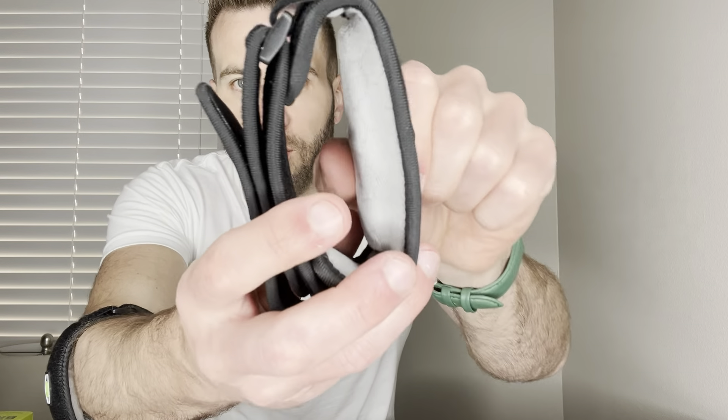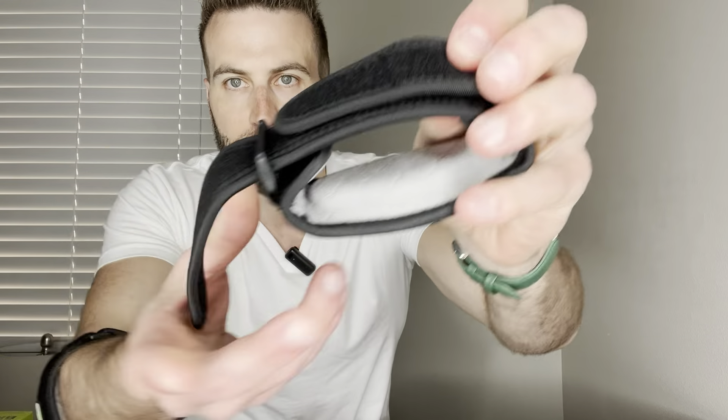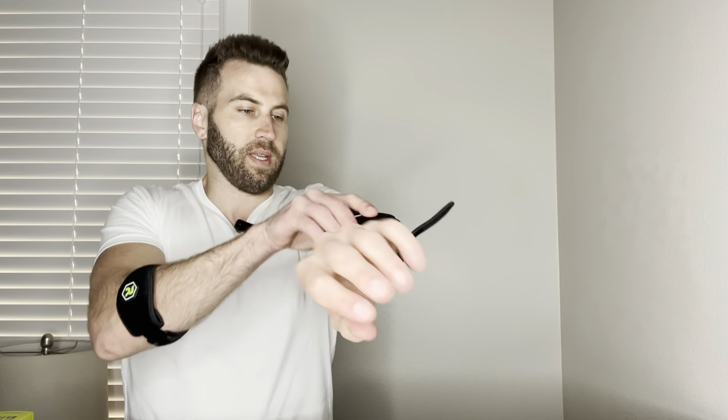Just to show you — give you the quick vibe — we've got this nice little padded area up here with the logo. You've got the straps back here that cause it to fit just perfectly for anyone. Let's go ahead and pull this on.